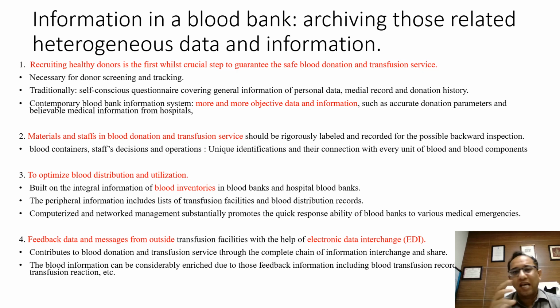Traditionally, we used to have a self-conscious questionnaire that we used to give to the donor. And once we had that information, we used to self-enter it, and that was it. Now, in a contemporary blood bank, more and more objective data and information is there, like accurate donor parameters, medical information from the hospital, etc. So, recruiting healthy donors is a very, very vital part of the information.